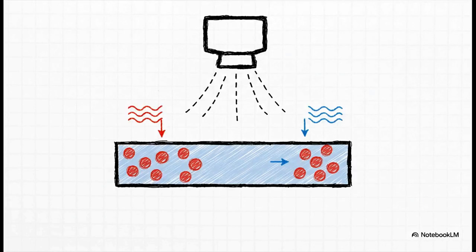And now we get to the real powerhouse of hemodynamic assessment, the Doppler effect. You already know this principle from everyday life. It's what makes an ambulance siren sound higher-pitched as it's racing towards you and lower-pitched as it moves away. We do the exact same thing with echo.